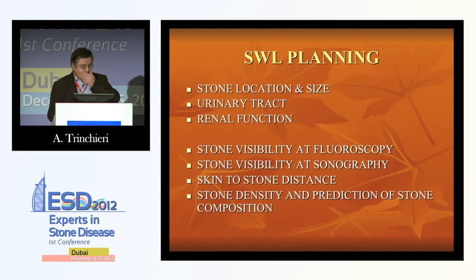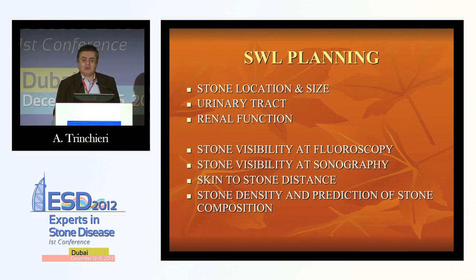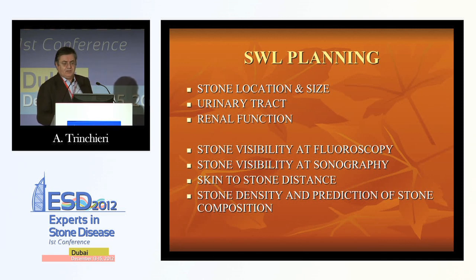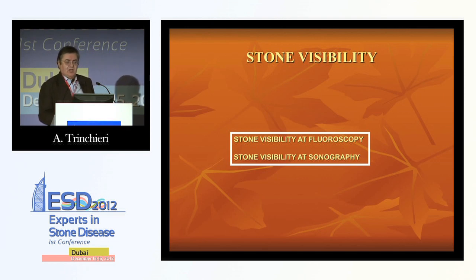Another point that we must make is that you have to verify your information when you plan a treatment in extracorporeal shockwave lithotripsy. You have to confirm your information of the stone location on the basis of your machine, because sometimes it's not possible to have the same information you have in your pre-treatment imaging charts, because on your machine the stone is not demonstrable because of the limits of the imaging of the lithotripter.